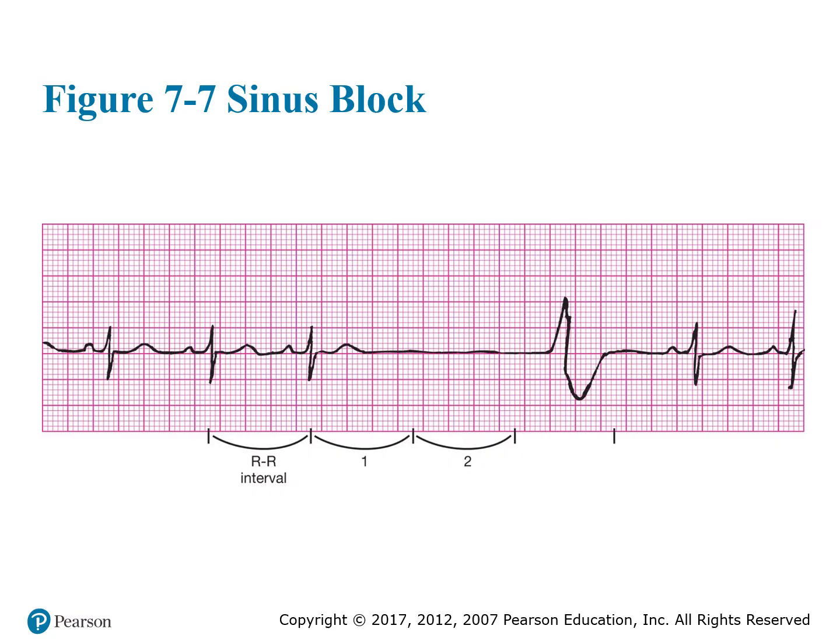Sinus block. Right, so we got a beat. Should have had a beat. Should have had a beat. Should have had a beat. Got a beat. Right. So we had 2 or 3 beats in here that we missed a couple of beats.